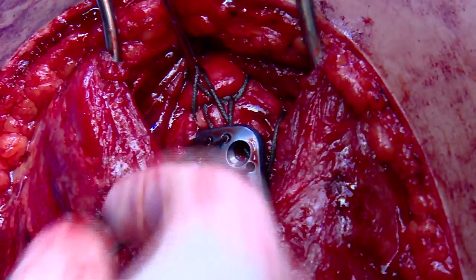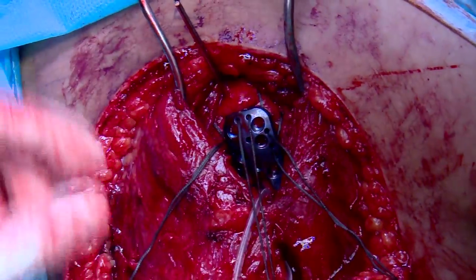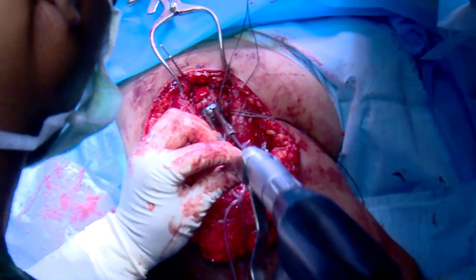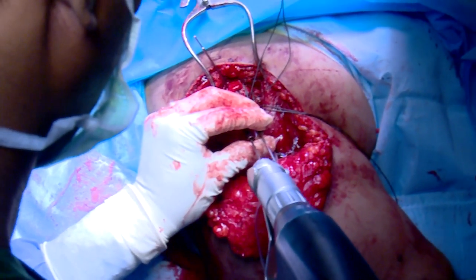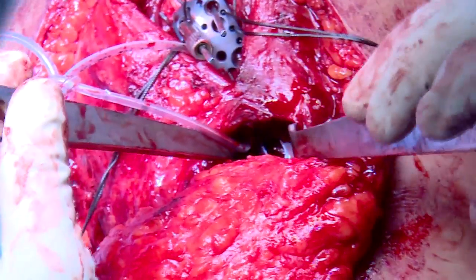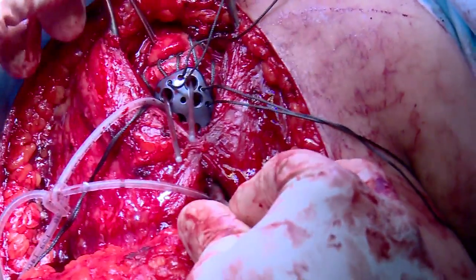The sutures are passed into the eyelets of the plate before inserting it, as it may become difficult to pass them later on. The plate is then slid safely under the axillary nerve and secured onto the proximal humerus. After securing it with K-wires, fracture reduction and position of the plate are confirmed by fluoroscopy in both planes. It is ensured the plate is centered on the humeral head and shaft at an appropriate height from the top of the humeral head.